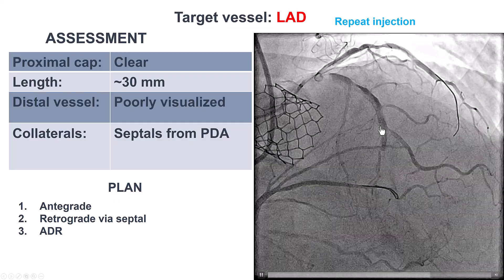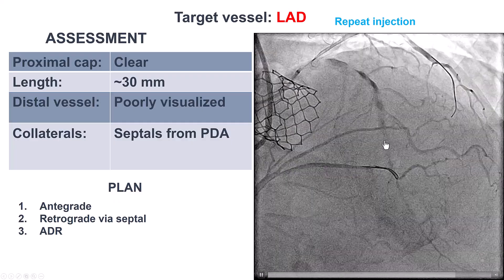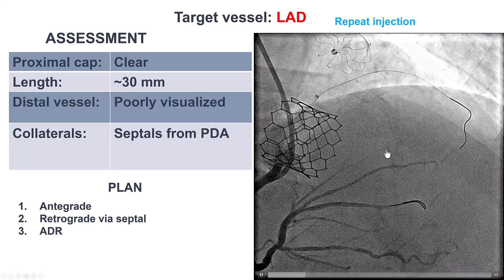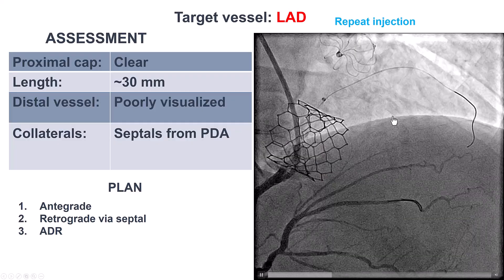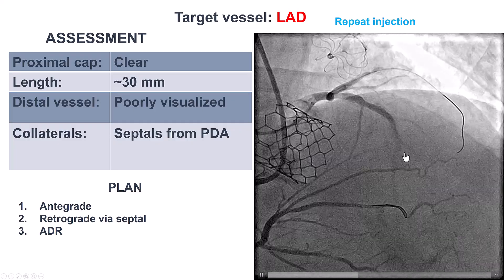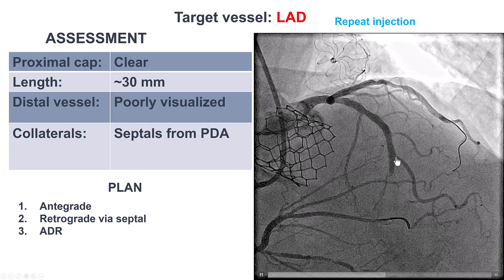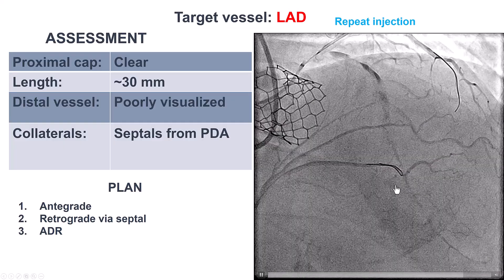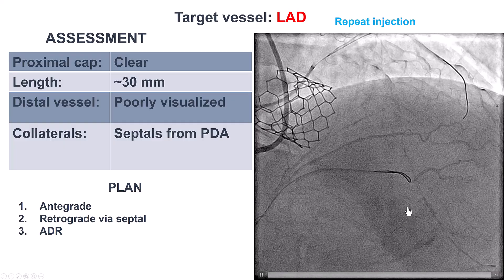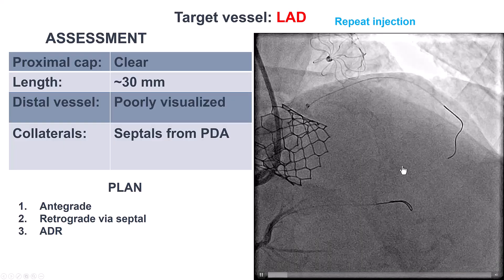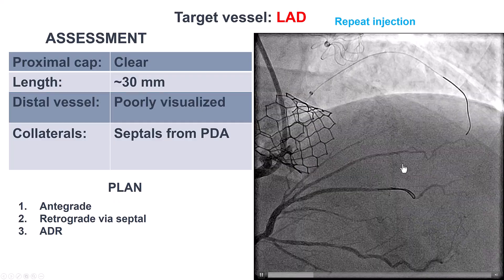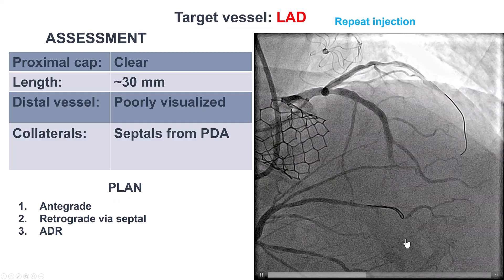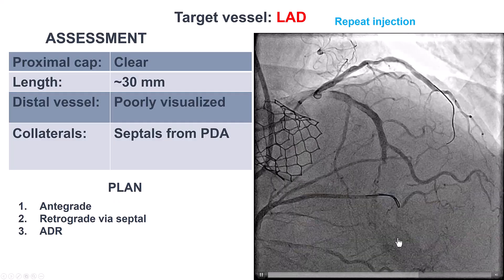We do have a CTO of the mid-LAD. It has a well-defined proximal cap. There is heavy calcification within the LAD. The distal vessel is filling through collaterals, mainly from the right coronary artery. The CTO is about 30 millimeters, and the distal vessel is diffusely diseased.